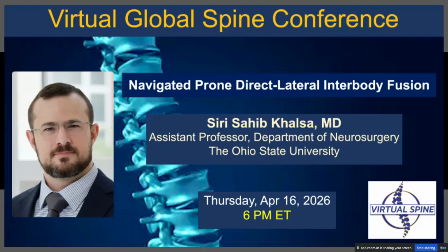Yeah, you're right. This is definitely, I think, my preferred approach now. There's some weeks where we have 3 or 4 of these. I feel ready to make that jump, especially if you've had success. And I also like the idea that you can control posteriorly. You could place a temporary rod and kind of mitigate any issues if you do end up destabilizing more than you wished with an ALL rupture.